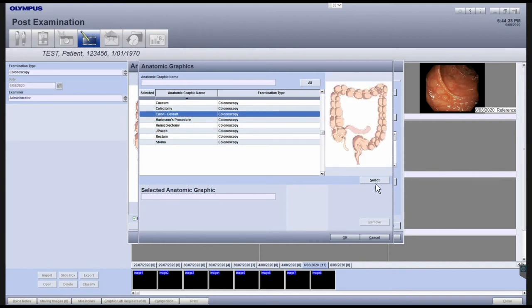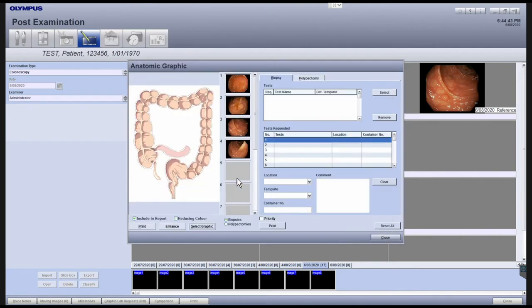To select the image, press the Select button and this graphic will be available. To indicate where an image was captured, drag and drop each of the images to the appropriate location on the anatomy. This will create a number marker for that image that will be displayed on the report.